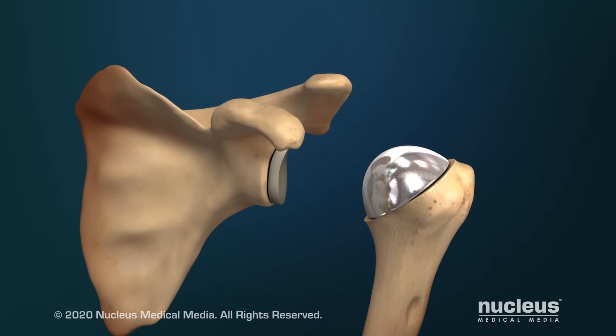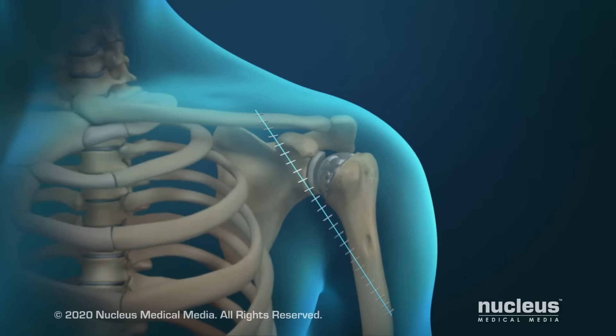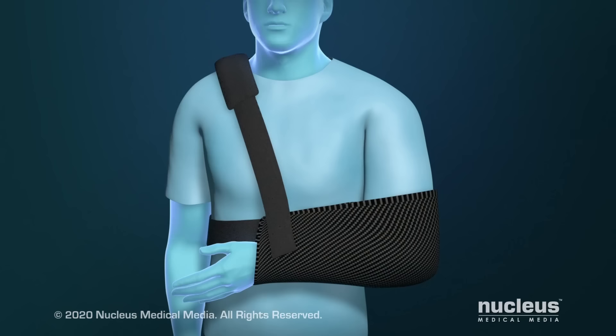Finally, your surgeon will slide the ball of the prosthesis into the new socket. At the end of the procedure, the incision will be closed with staples or stitches.